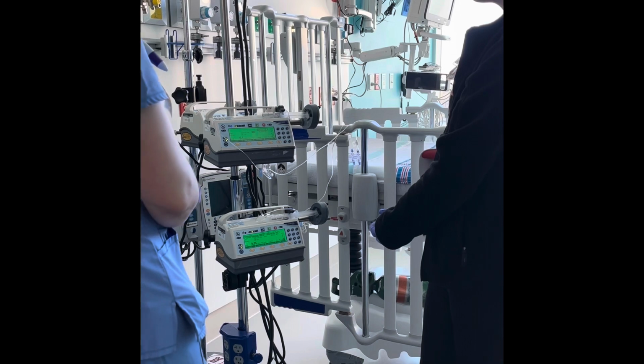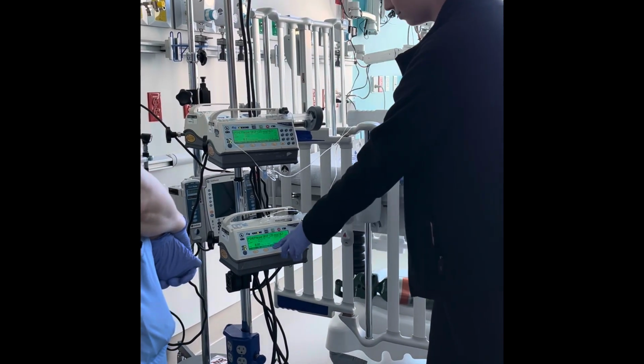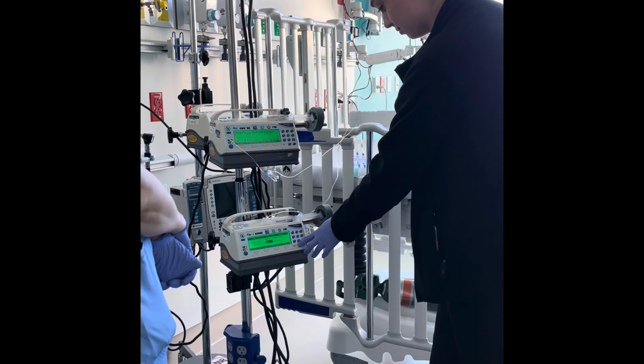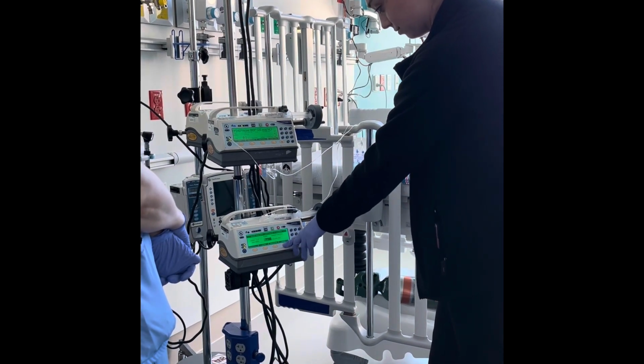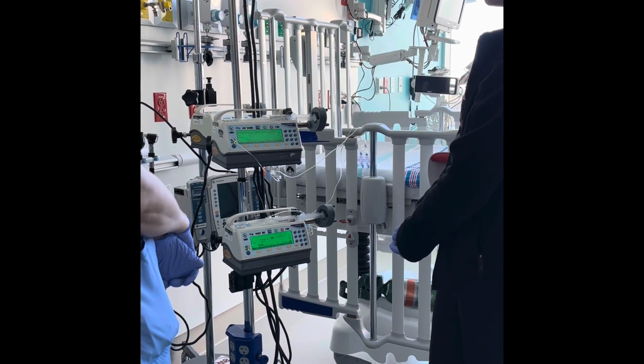You will continue to wean off your old infusion by 0.01 mics per kilo per minute every 1 to 3 minutes, with each dose change requiring an independent double verification.